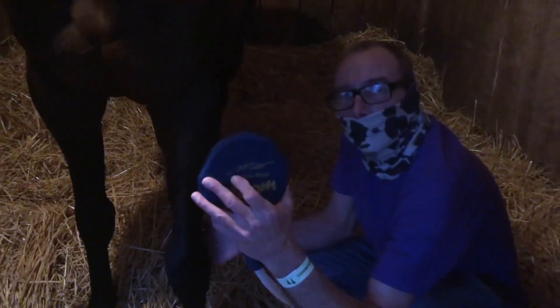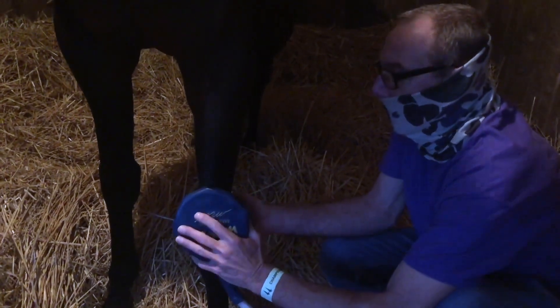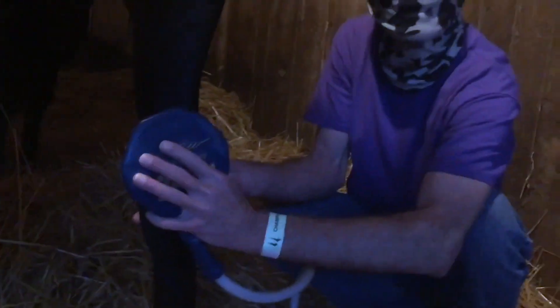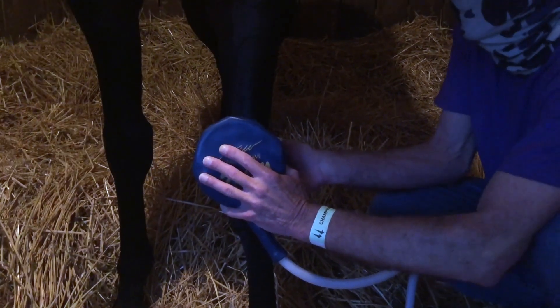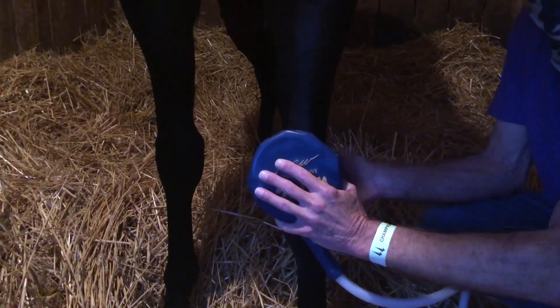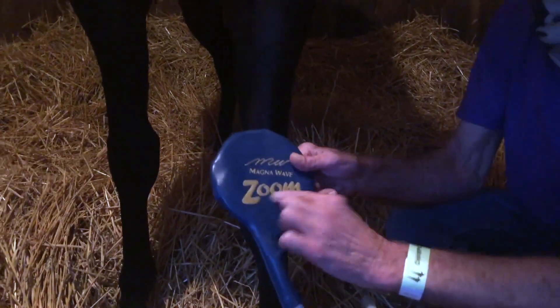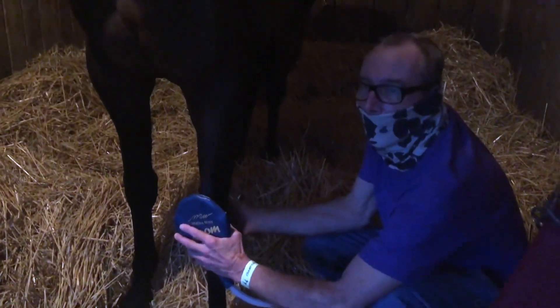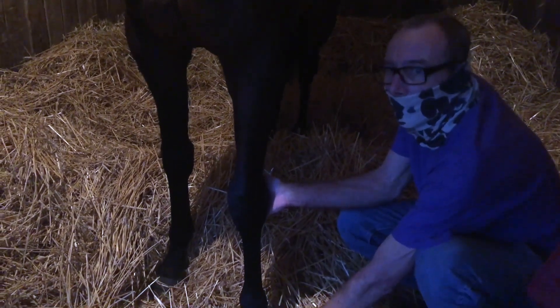This is the paddle — that's my favorite of all the connections. I'm going to do his knees now and move it around — I'll do a couple minutes and go to the sides and the back. He likes this one. If you really have a problem area, it penetrates more — it even says 'zoom' on it. If he had sore shoulders, I'd put it on there and turn the intensity up as much as he could stand it. It really helps a lot. And this is for the feet — this is all you can use on the feet. I'll put it right here on the coronet band.